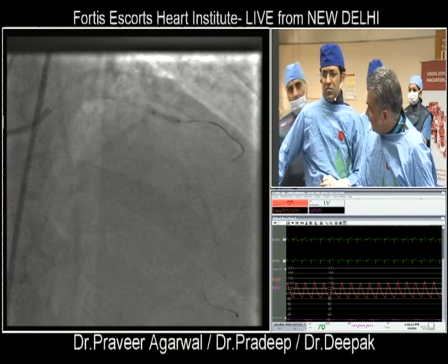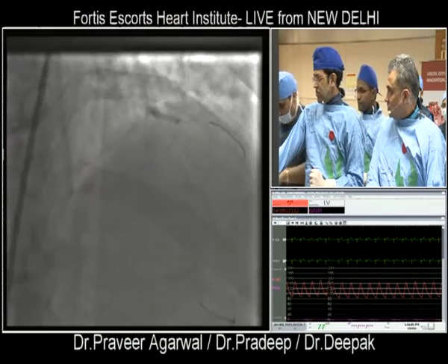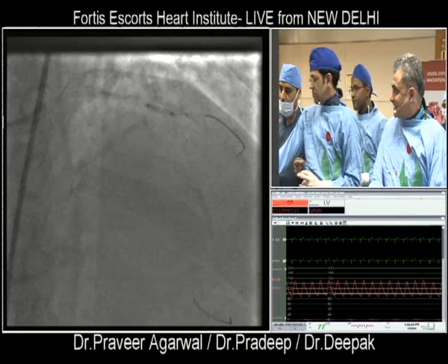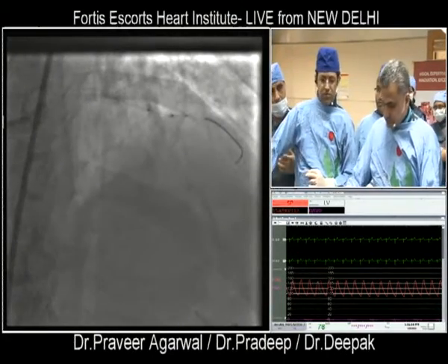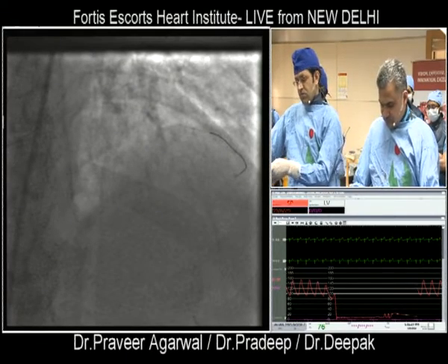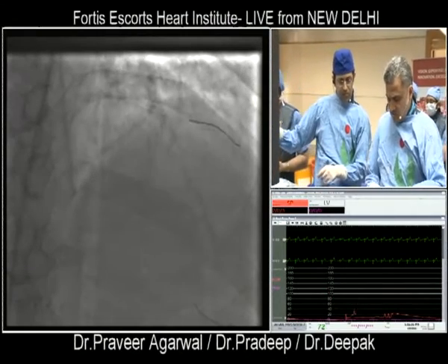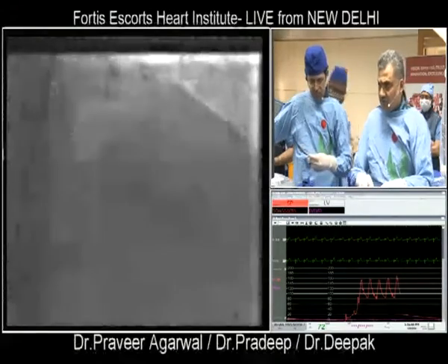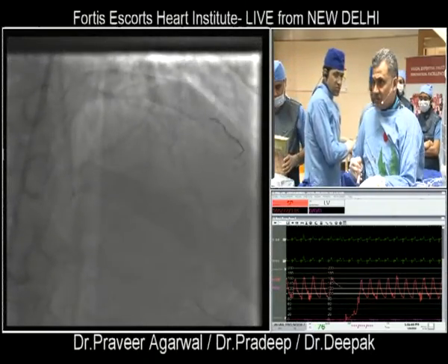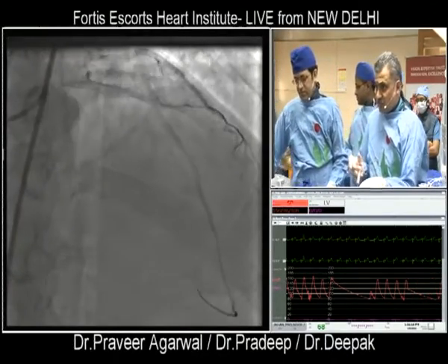So we have 2.5, 3, 40. We have an option of 2.5, 3 into 40, that is 2.5 distal and 3 proximal and 40 length. And we have got an option of 2.25, 2.75, 40. There was even some doubt that the proximal part of the LAD after the stent would be even bigger than 3, approaching the 3.5. So 2.5 into 3, 40. Give us 2.5, 3 into 40.